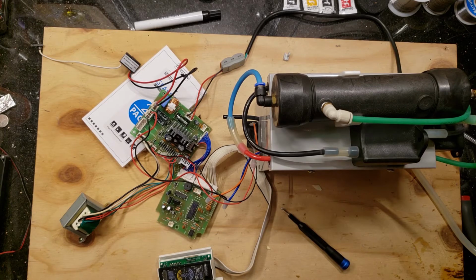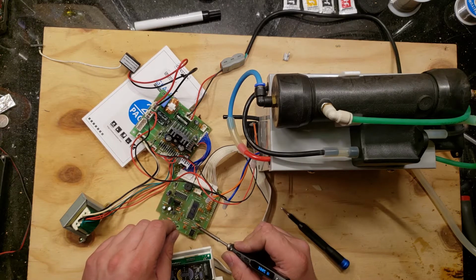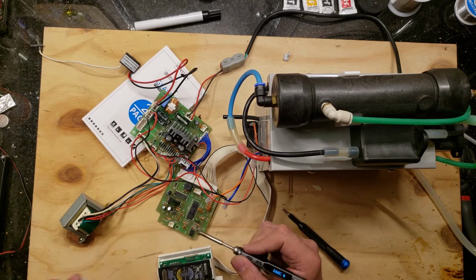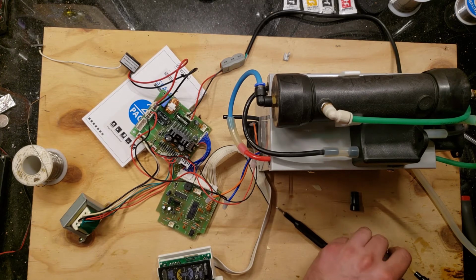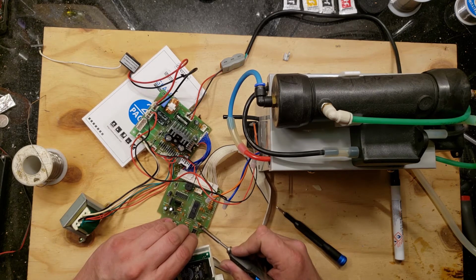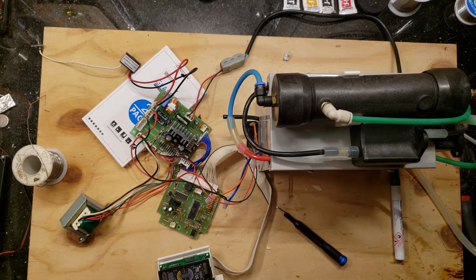Well, I couldn't find the 22K, but I found a 2.2K. So let's see if that does anything, or if the magic smoke's gonna come out. Oops. Come on. There you go. Well, let's see what that does.